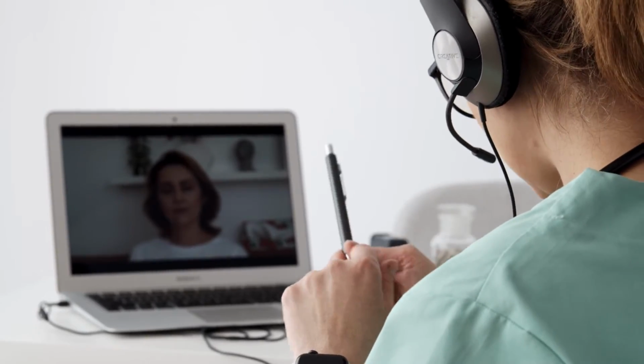As I said, the guidelines were written for adults, and I also want to point out that they were written for Dexcom G5. We now have G6 and G7, but since there's been no updates to the arrows, I think you can use those for 6 and 7 as well. I also want to point out that, of course, these are guidelines. If in any way in doubt of whether or not this is for you, or even if you're not in doubt, you should still have a conversation with your doctor about how to use the arrows.